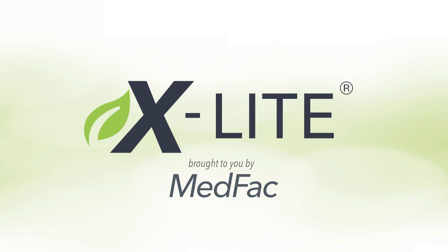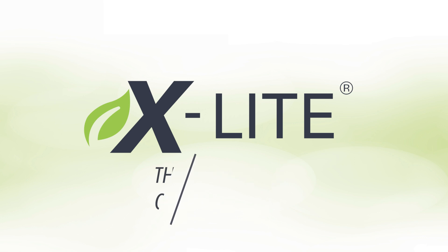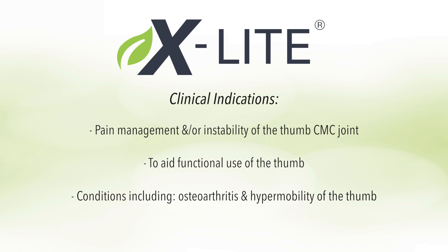In this tutorial we will be showing you how to fabricate a thumb spica orthosis. The clinical indications are pain management and/or instability of the thumb CMC joint, to aid functional use of the thumb, and to treat conditions including osteoarthritis and hypermobility of the thumb.